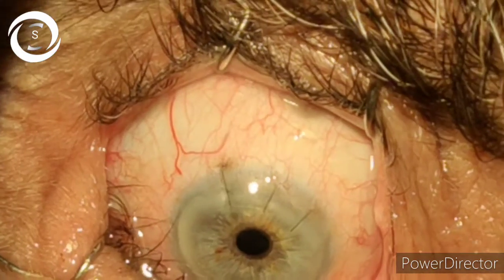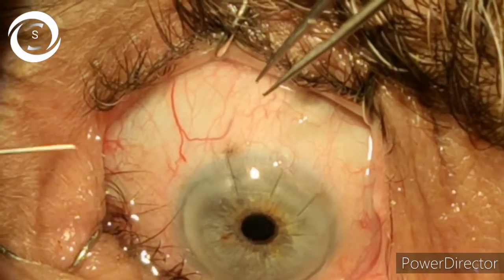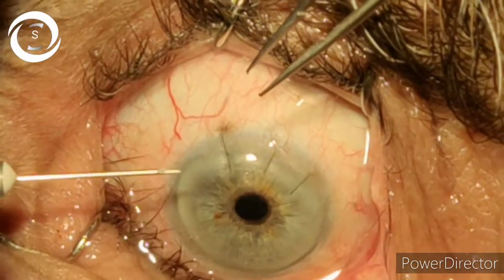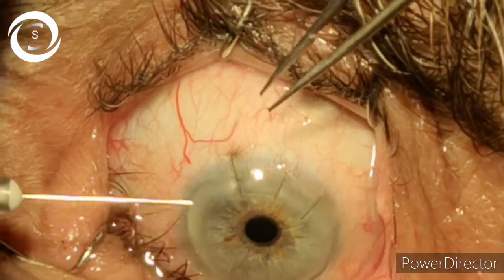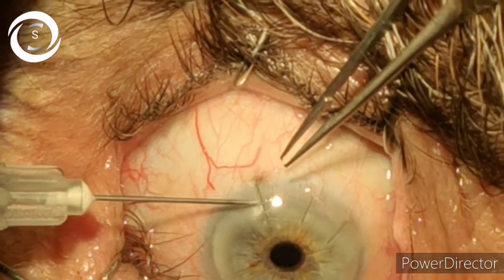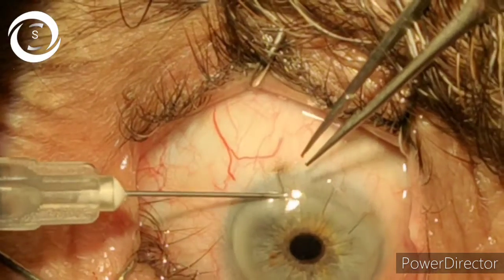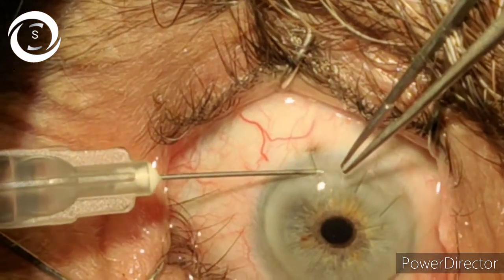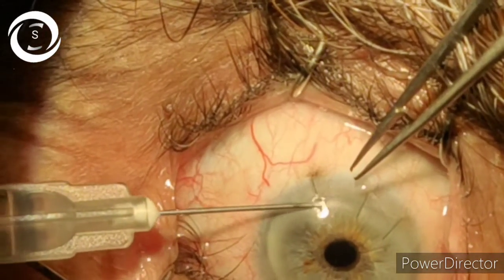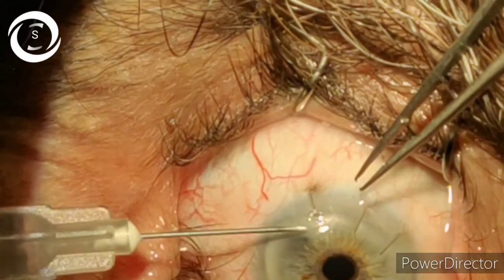The patient is pseudophakic and you can see three interrupted sutures. Take a 1cc needle with the bevel end downwards, go under the suture in the middle, try to elevate it first from the cornea, and then cut it with the sharp needle.